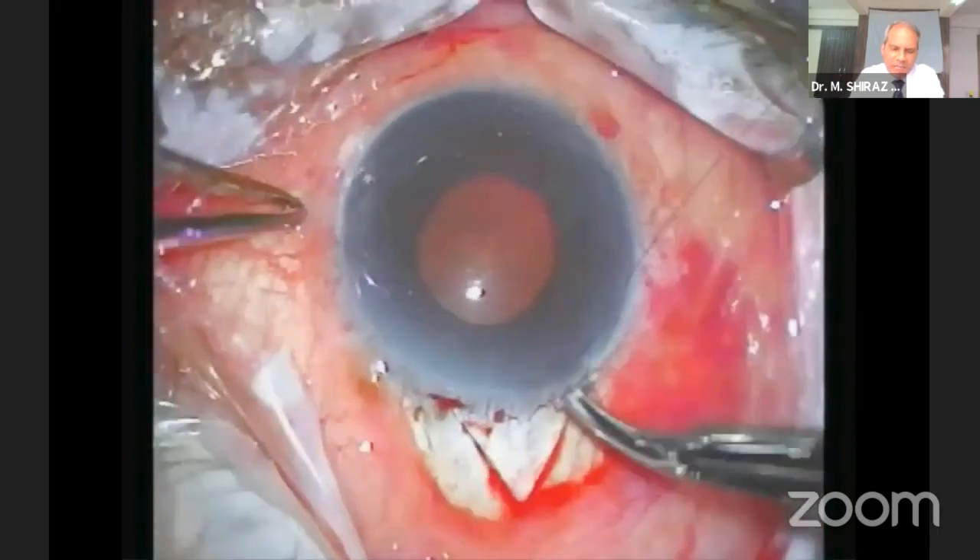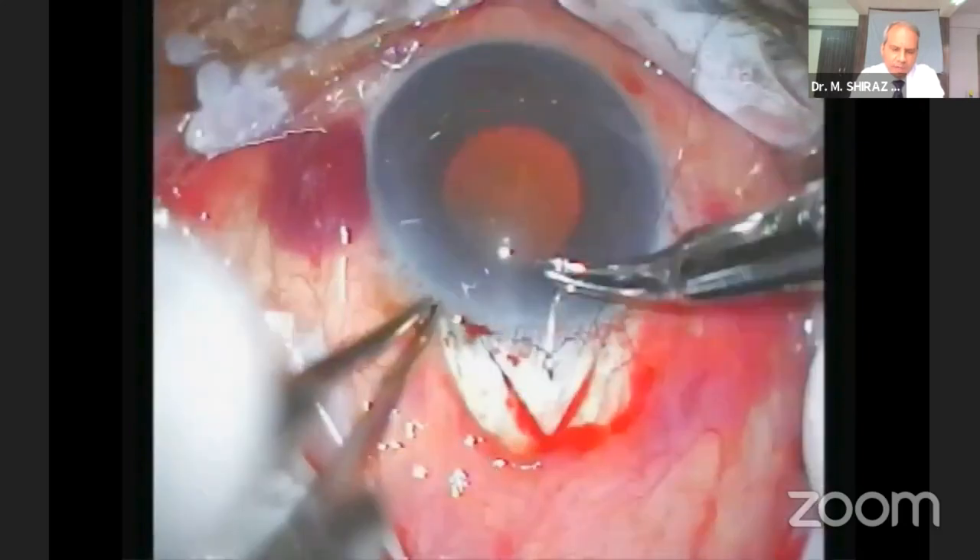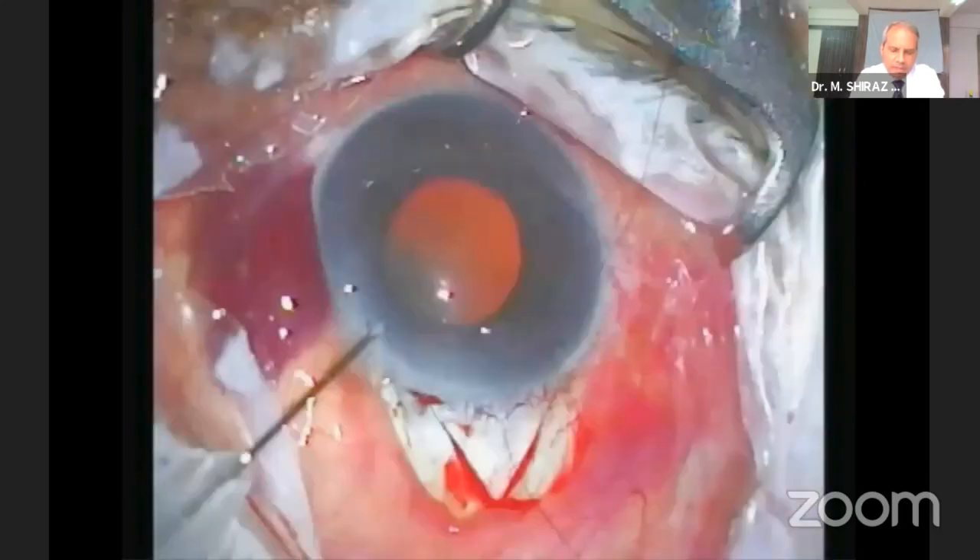Depending upon the case and surgeon's preference, scleral flap sutures can be pre-placed. Here, a releasable suture is being applied. Paracentesis is done.